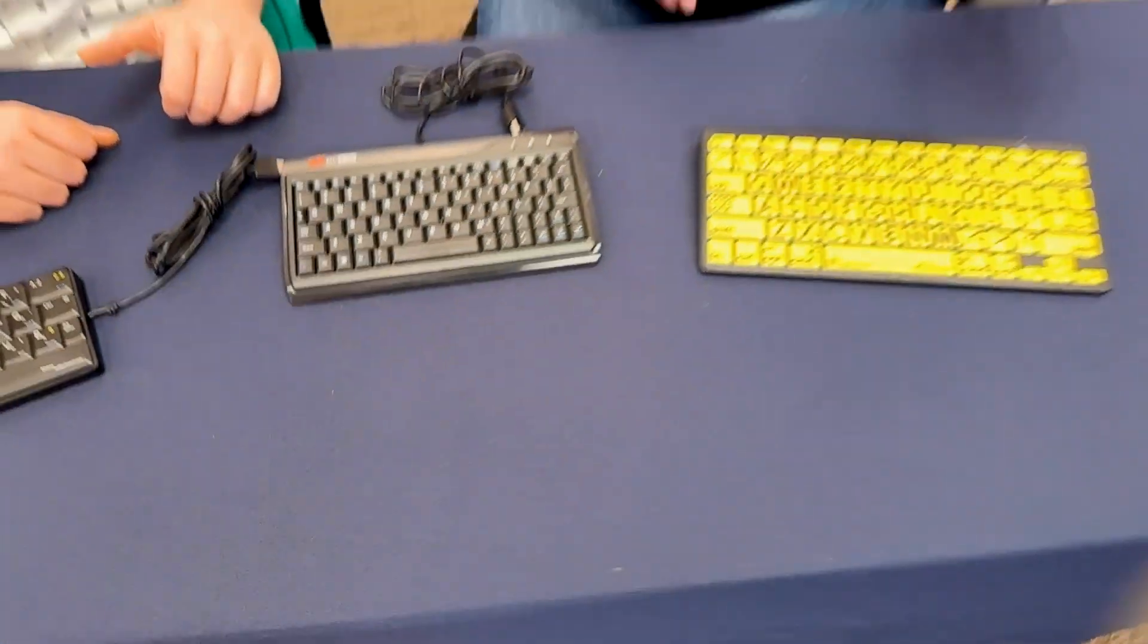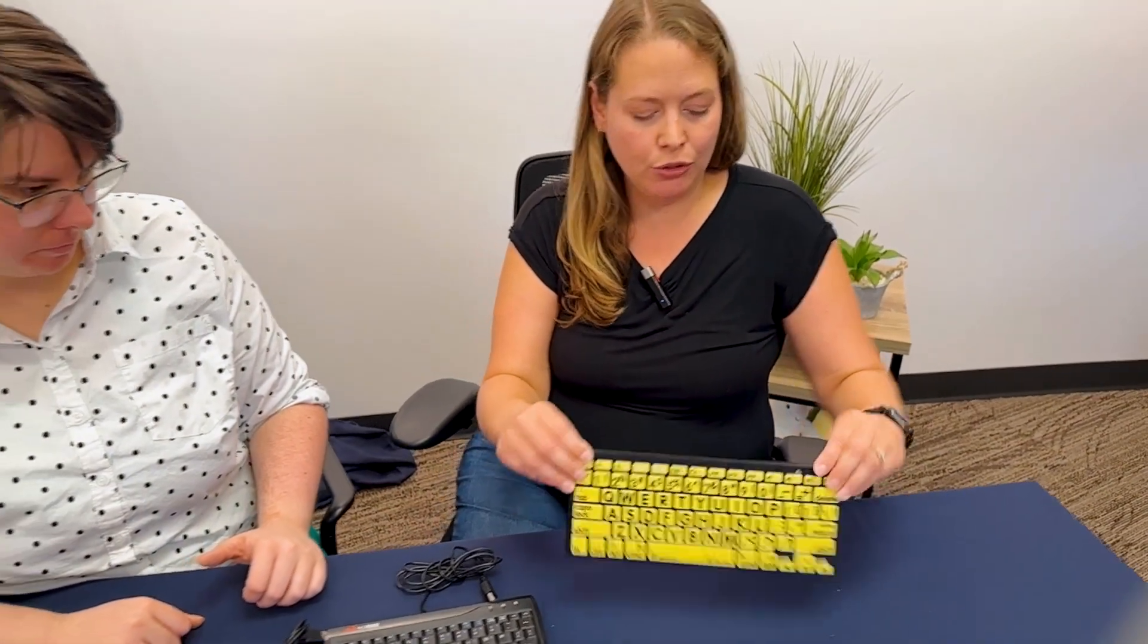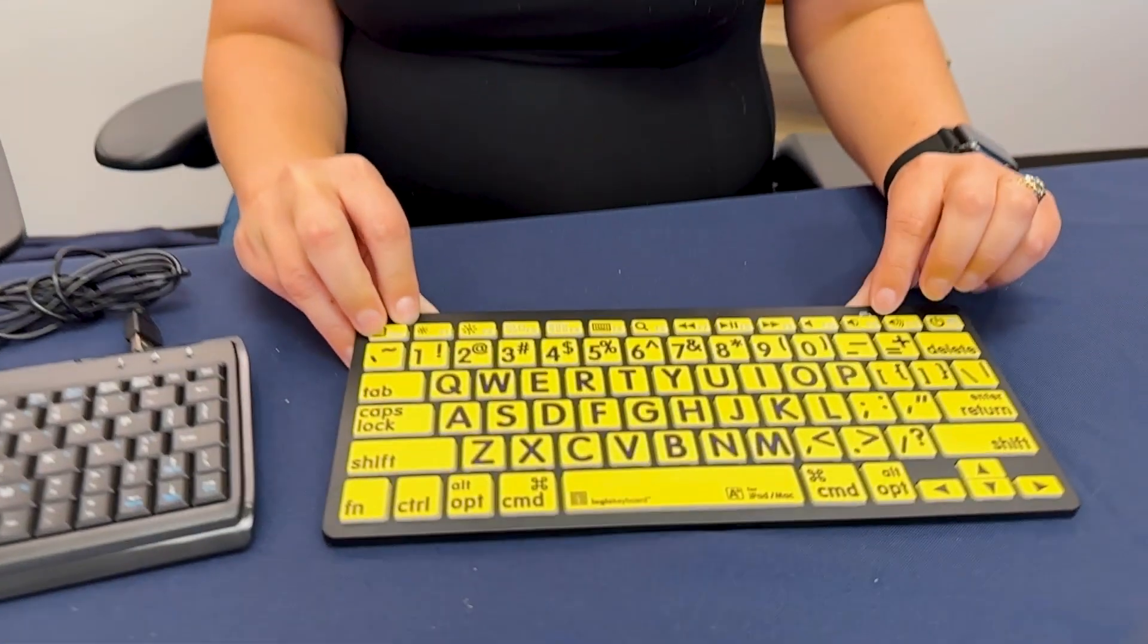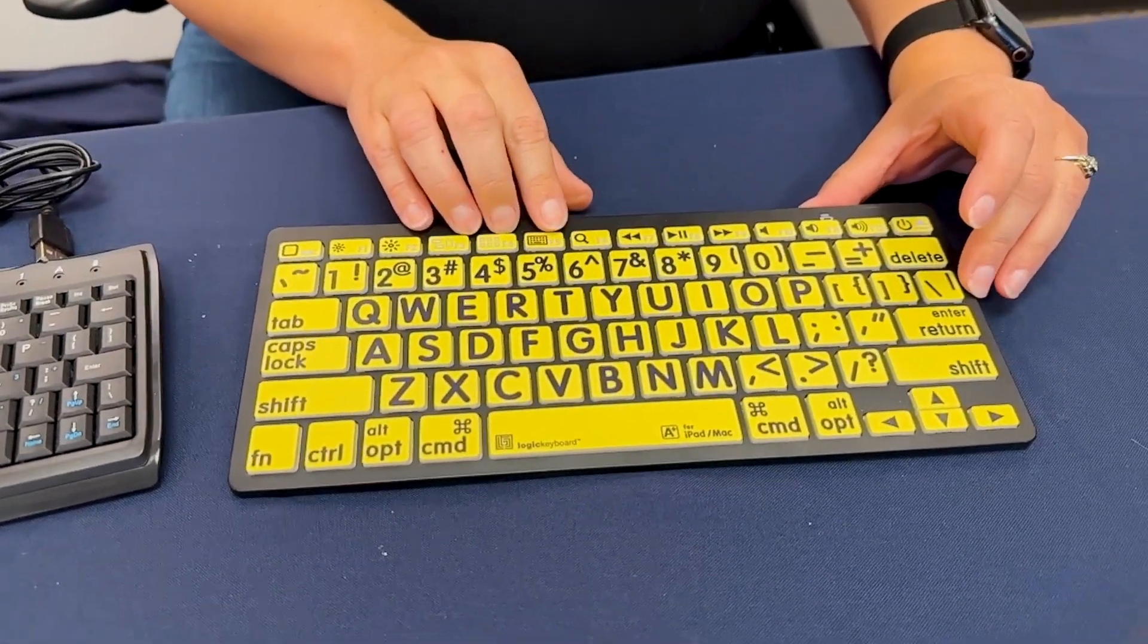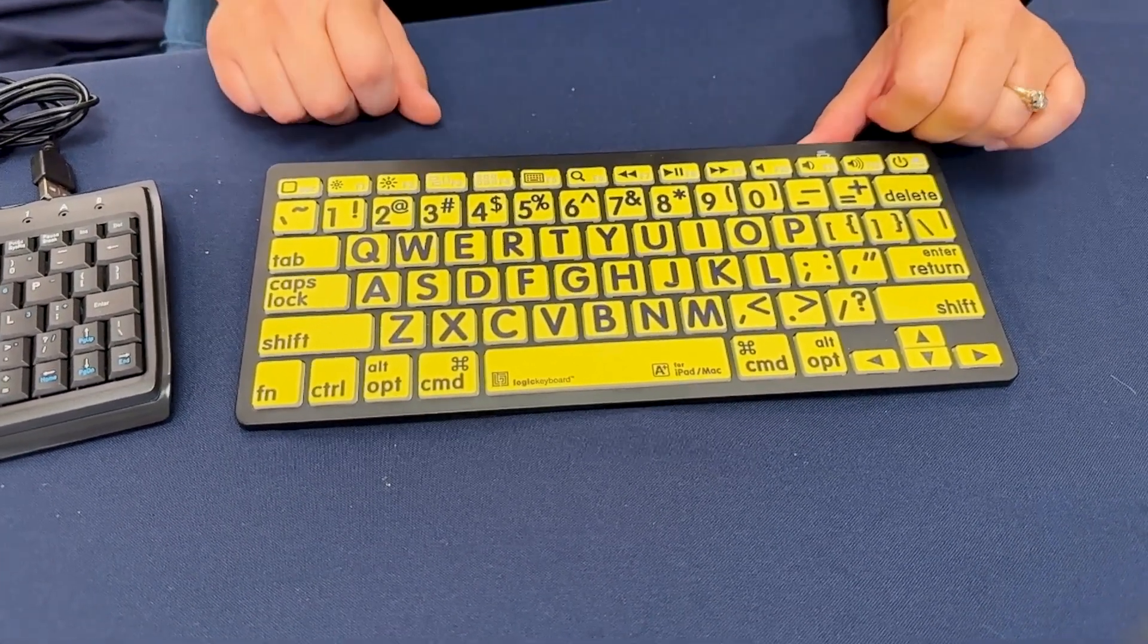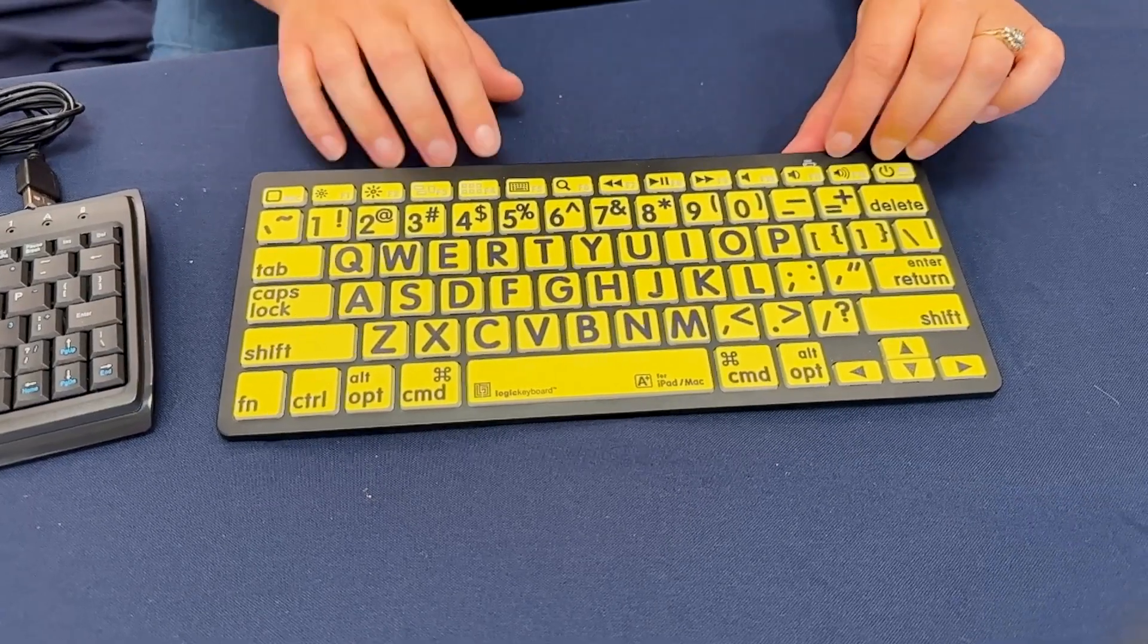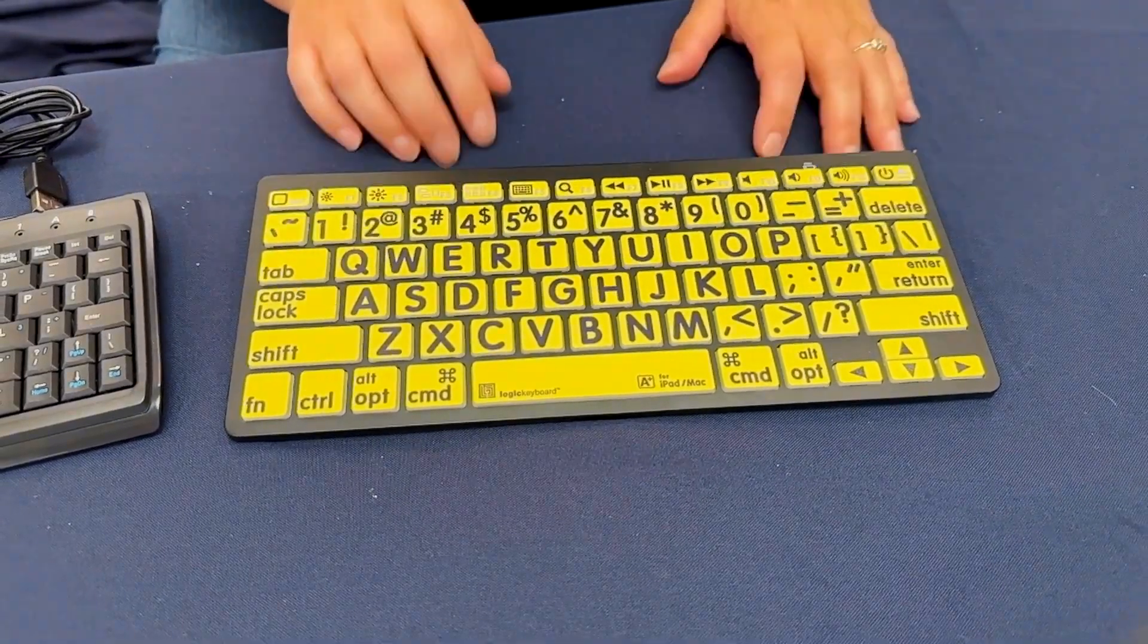This is a little bit larger version. It's a Bluetooth keyboard and it's also low vision, so it has these great high contrast buttons with a yellow background and black capitalized letters.